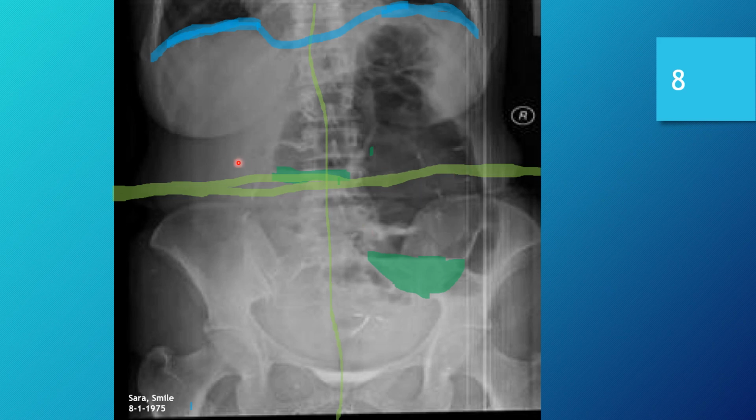At the same time, however, visibility on this side is not great. Could be due to the breast shadow, but I do not see an area of gastric air, which would indicate the stomach being here. We do have a lot of air here, but it would almost certainly obscure that. But my concern is that this image was marked incorrectly, which is possible.